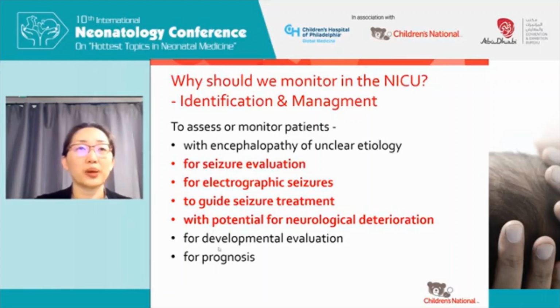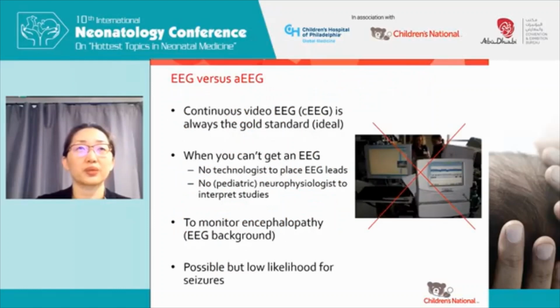It can also tell you about maturation, in terms of whether the baby is age appropriate or not, delayed, or potentially may have congenital reasons for having a static encephalopathy. So an AEEG isn't to replace the EEG. It should be a way to supplement or expand your capabilities if your access to EEG is limited.